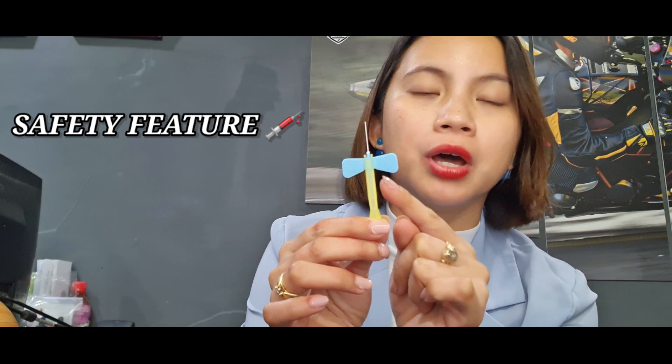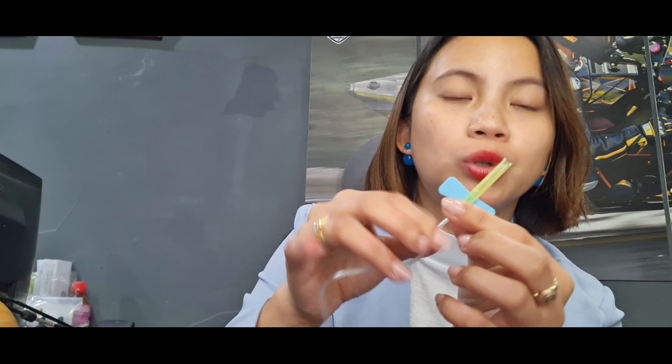I'll show you the safety feature. So when you're done getting blood from the patient, you just push it going up, and this will lock and cover your needle totally. So as you can see, this has a safety feature. We also have another type of winged infusion set.